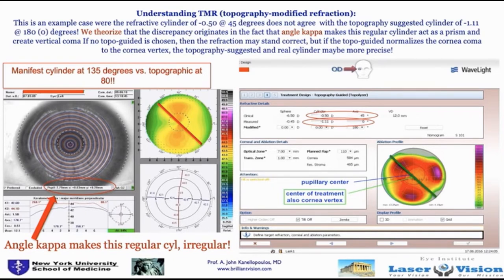There's nothing wrong with this patient. Pentacam is fine. Thickness is fine. He's been off contact lenses. What's tricky about this case? The tricky thing is that we all agree here that the astigmatism is almost on dot with the rule, right? It's a vertical bow tie. His refractive astigmatism is way off. So his refraction, dry, wet, autorefractor, and wavefront is different.